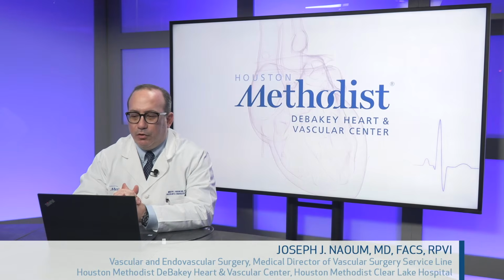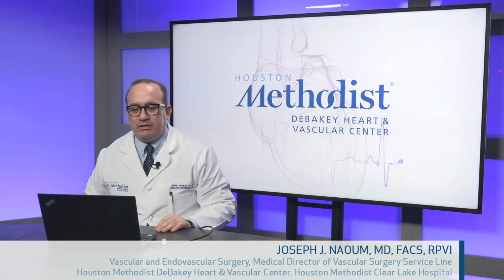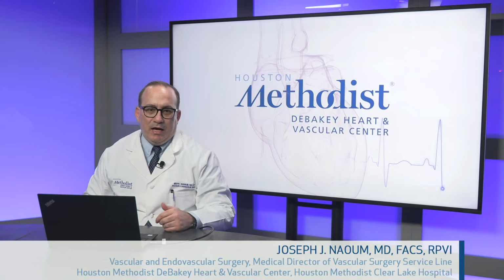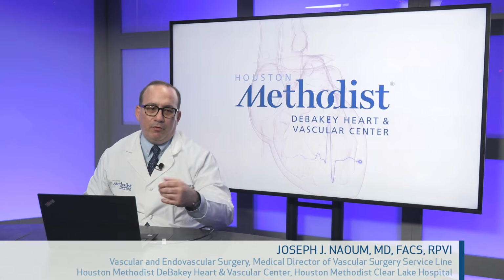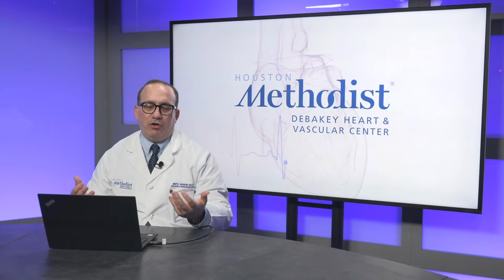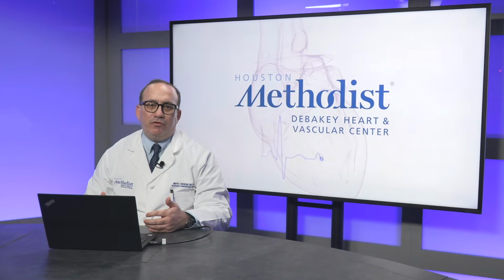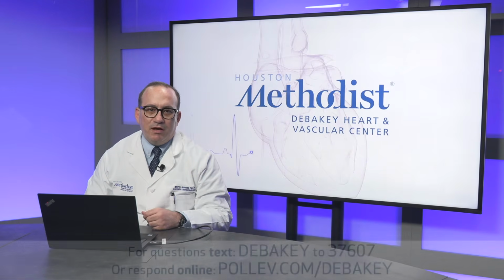We're going to be talking about lower extremity arterial exams. We're going to cover both physiologic and arterial duplex examination. We're going to talk about different ways in which we interpret these exams, and specifically how to really read the language of the waveforms. I believe that there's two components. It's almost like a book. There's the technical part, which is the numerical values, but then there's also the words and the meaning of those words, and those words are represented to us by waveforms.